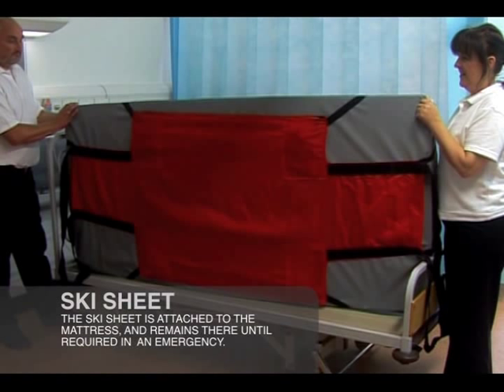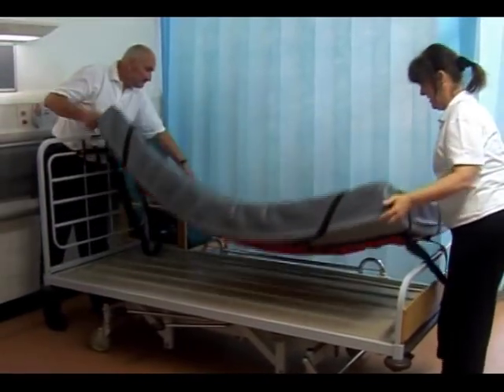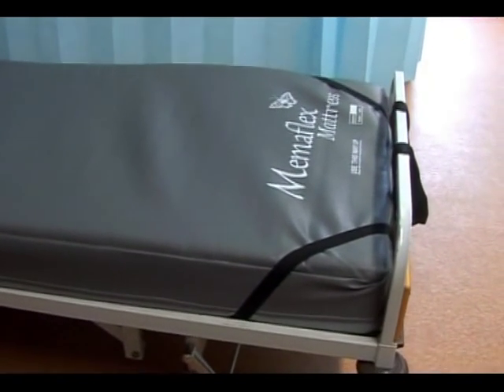The ski sheet is attached to the underside of the mattress by the four elastic corner handles, with the white label facing the underside of the mattress. Replace the mattress onto the bed and then tuck the end pulling straps under the mattress.